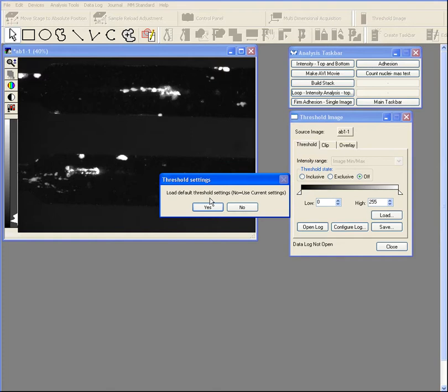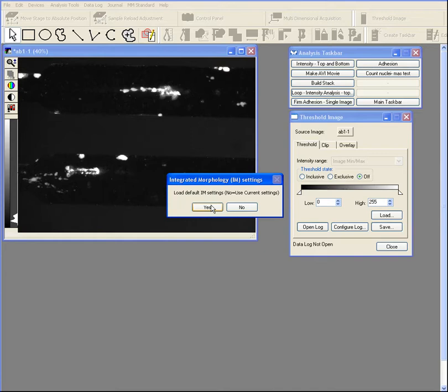And then it asks us if we want to use the default or the current settings. We're going to use the default settings which are pre-programmed for this analysis.